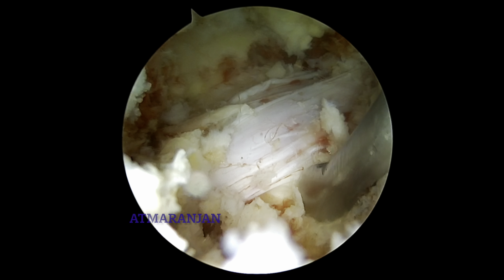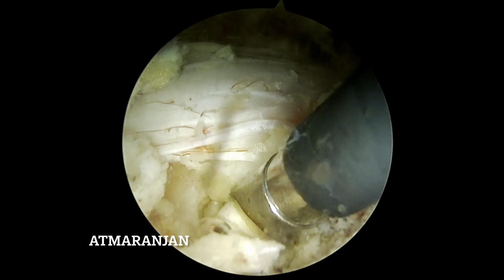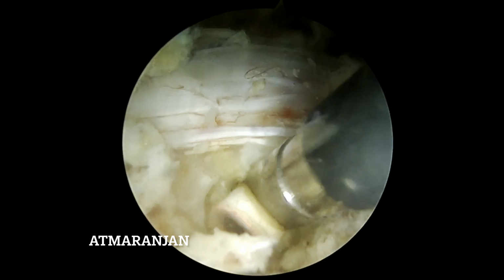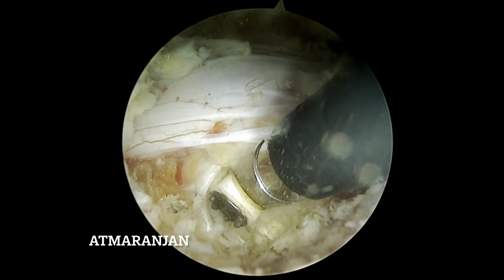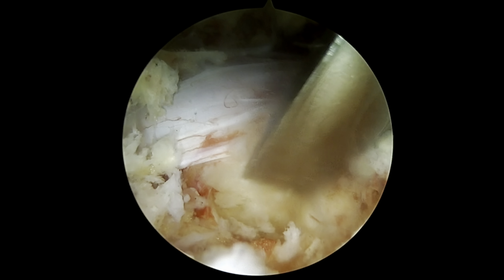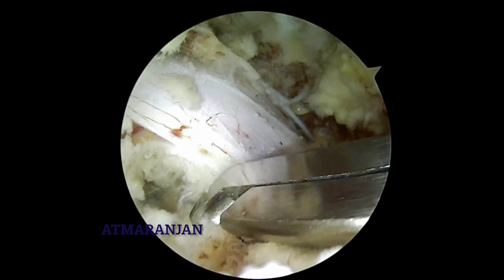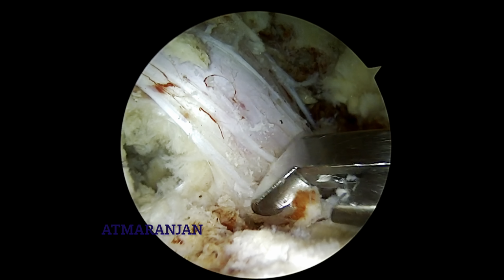Now the knife going in, making the first annulotomy. Then with the RF radiofrequency ablation setting, I tried to make the annulotomy wider. Before doing the annulotomy, we always use coagulation to shrink the vessels. Then we move to the ablation settings for making the hole in the annulus, or annulotomy. Now we start going inside the disc space and expand the area so that we make a wonderful disc space preparation.